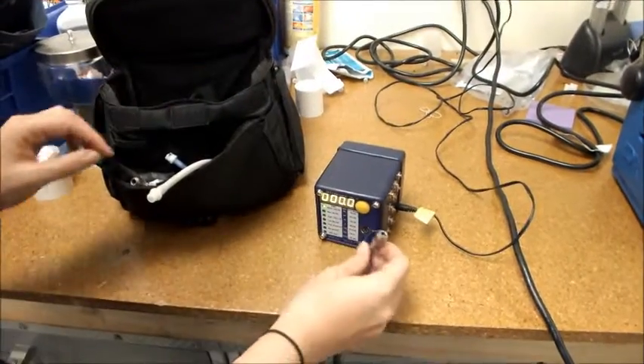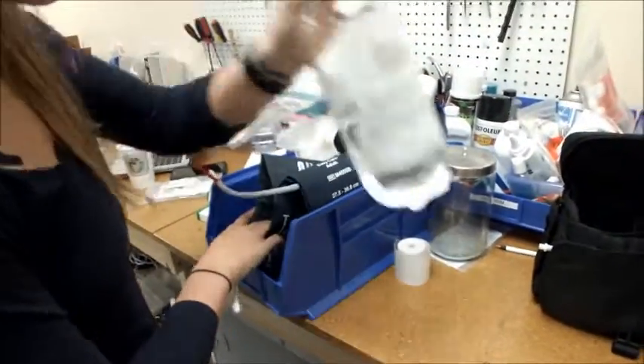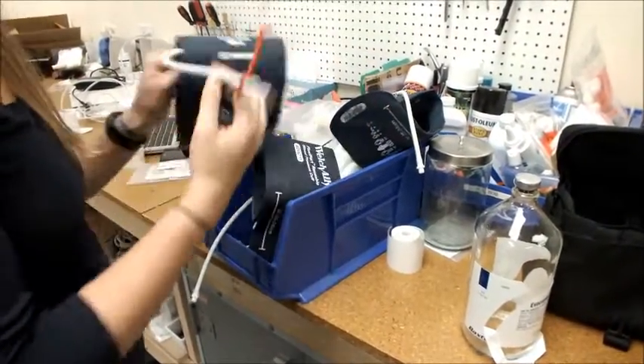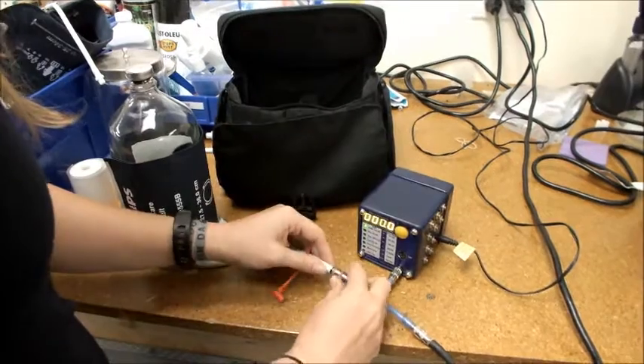Then I'm going to connect this end of the SimCube to a blood pressure cuff. I'll take out the bottle, which is what I'm going to test the blood pressure on, and then I'm going to look for a cuff with the appropriate connection as well. Then I'll slide the cuff over the bottle and connect it to the SimCube adapter.